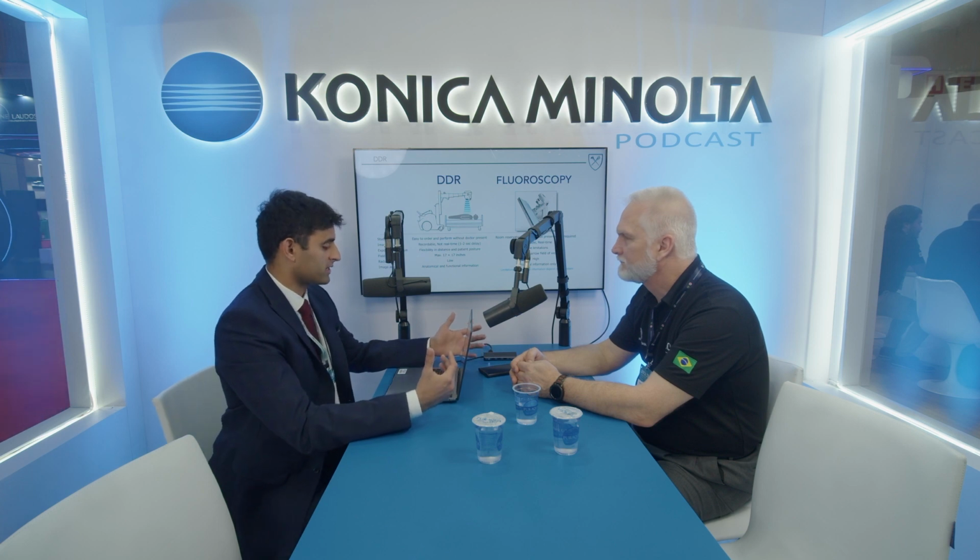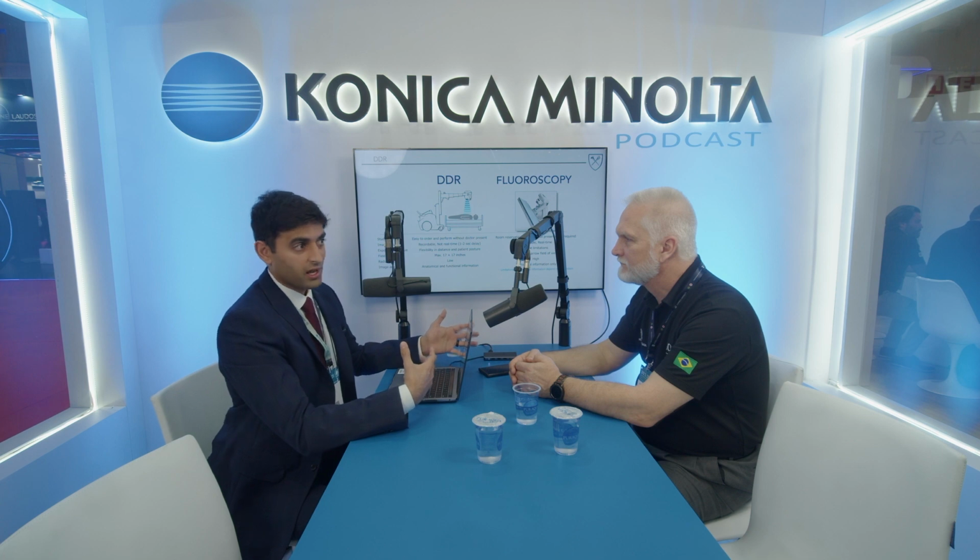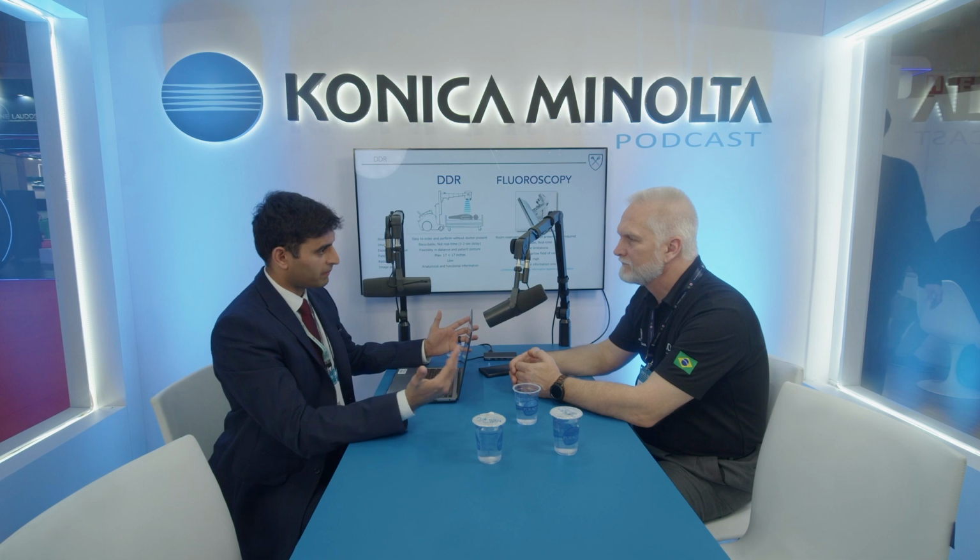And a number of ways, really. So firstly, it's easy to perform. From a clinical workflow point of view, we have trained technicians who are performing these studies without the physician needing to leave their clinic to do these studies. It's also recordable, which allows us to do a lot of research. The fact that we can go back after these patients have left and actually analyze the images and make measurements, as I'll go on to talk about in a little bit.